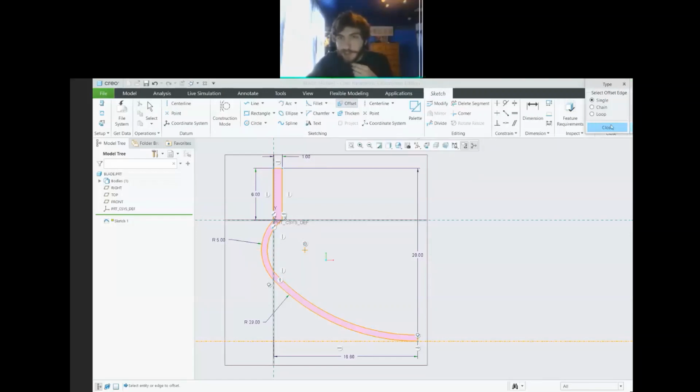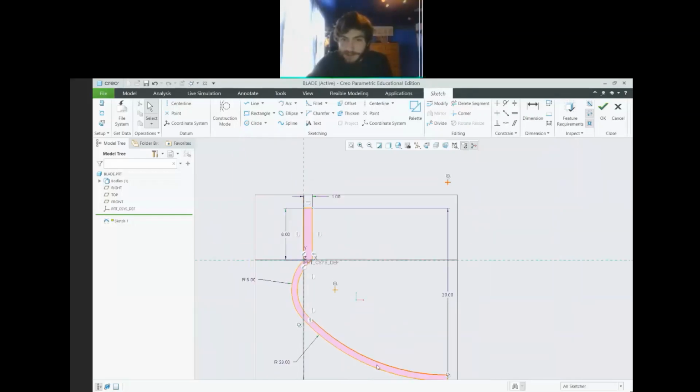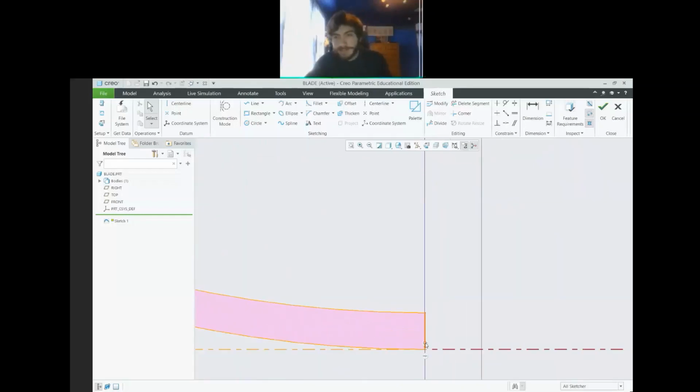And then when that created some smaller version of our arc, we used the coincident constraint, and we took one end of it and we attached it to our free hanging vertical line over here, just so we can get one continuous shape. We did the same thing for this bottom arc. We connected it to the end here, and then drew a vertical line to connect these 2 points.